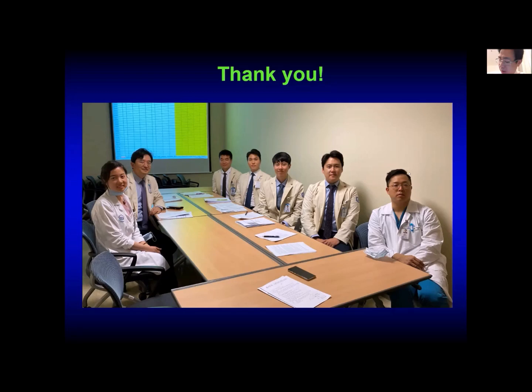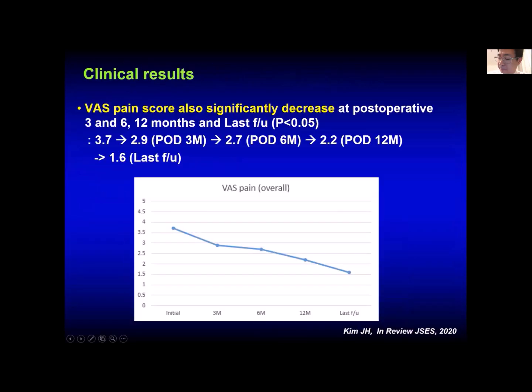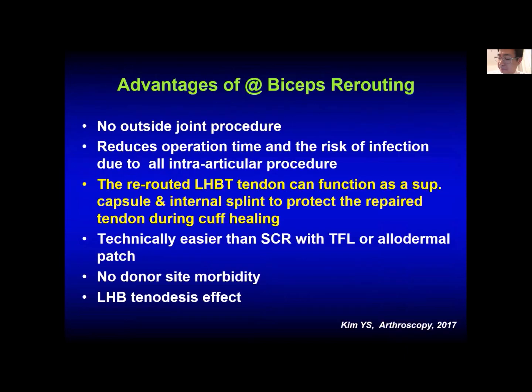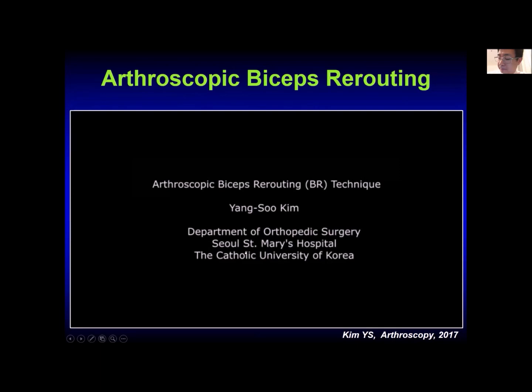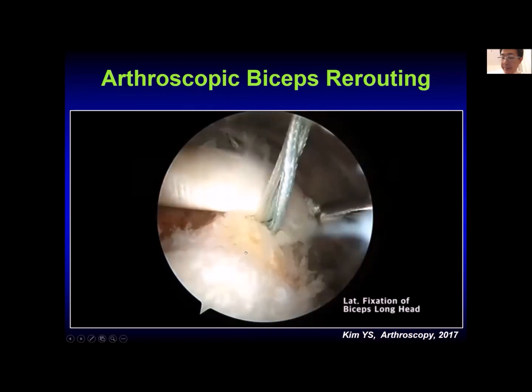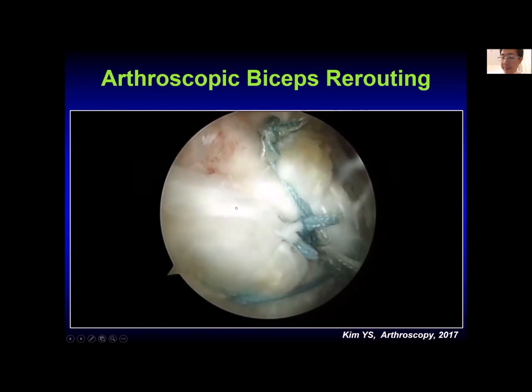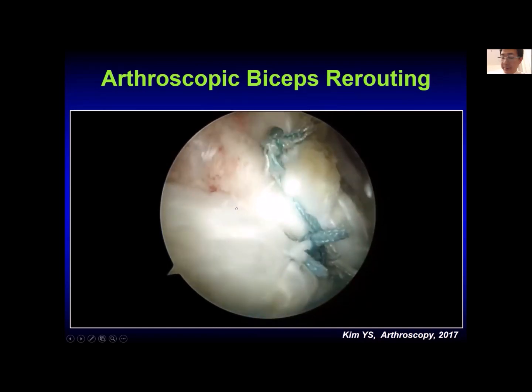But I think a partial tear of less than 25-30% can be available. I can use it because of the lateral anchor. I show you the lateral anchor. The lateral anchor is a loop, the loop biceps. When you reroute the biceps using the lateral anchor, the biceps is looped so the tendon is grabbed, and there's a tying in this procedure. The biceps tendon is together, making a loop shape. So I think we can use a not entirely healthy biceps for this technique.